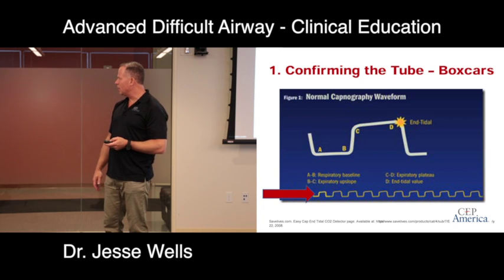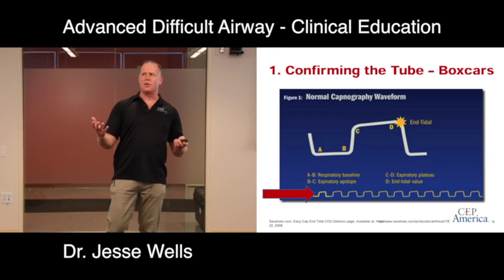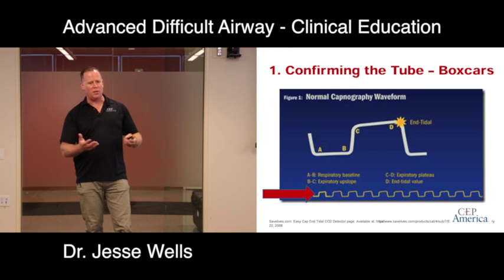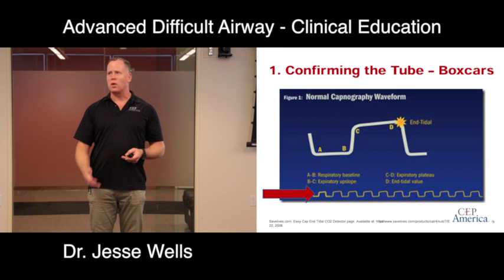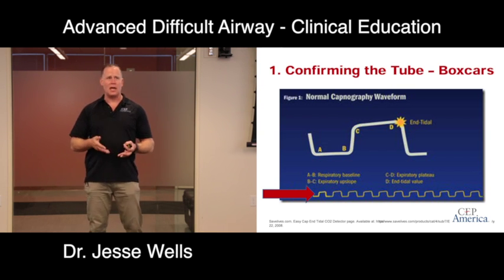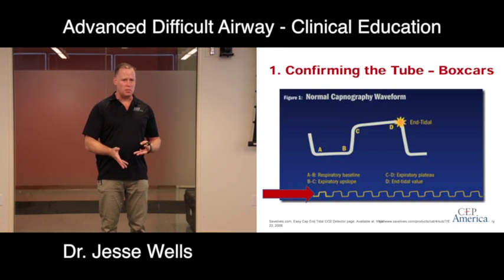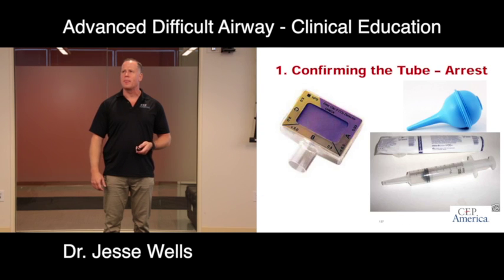Okay, so here's what I'm talking about. And see the shape of the tip here. That's called a catheter tip or Toomey syringe. Usually it's with the orogastric or nasogastric tube, and that's a quick, easy way. And before we had continuous capnography, I would test every EMS tube this way. Every EMS tube that came in, I would take the syringe and verify placement that way.